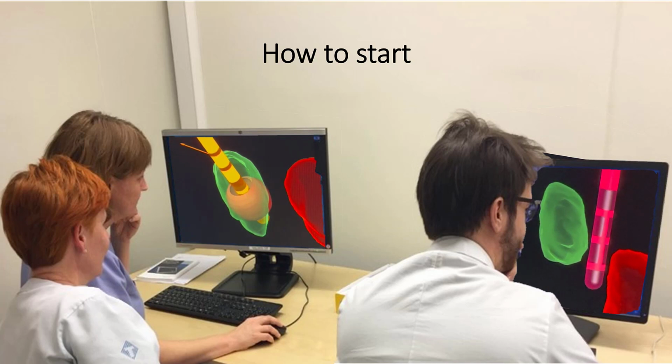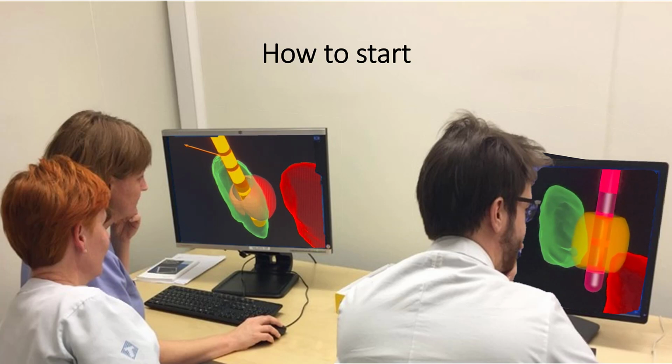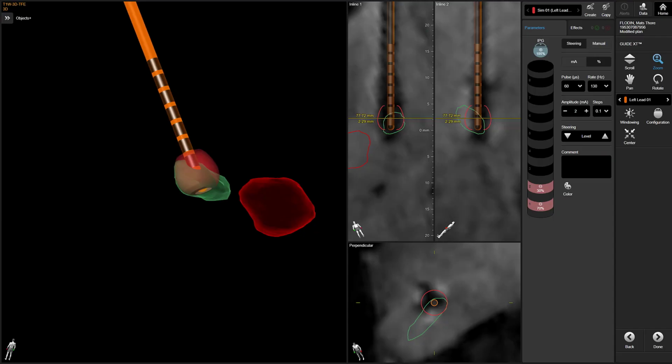Another good idea is that you then do the same with some patients with poor outcome to see if you notice any differences and can formulate a hypothesis why this might be the case. And this is of course not possible only for patients implanted with the new directional electrodes. You can as well analyze your previously implanted patients with omnidirectional leads.